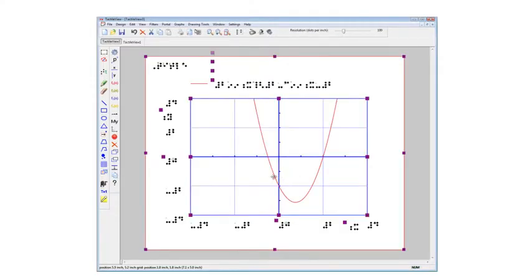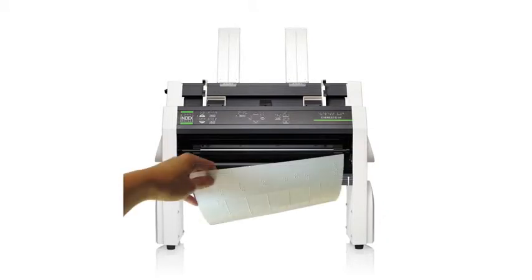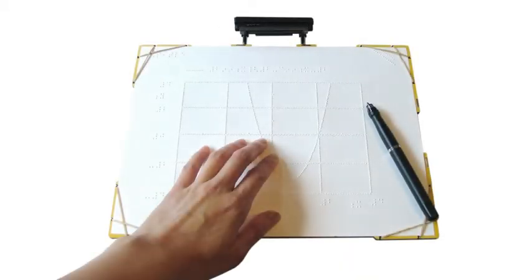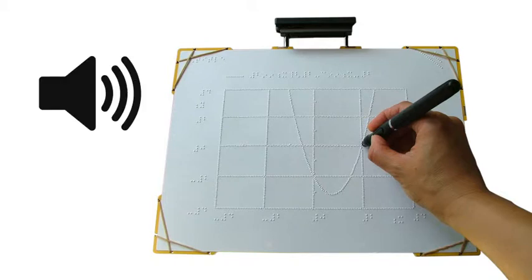When you're finished, simply print to your Index Braille Embosser and place on the TactiPad to explore your diagram. Use the digital pen to navigate your graphic and receive audio feedback at the same time.